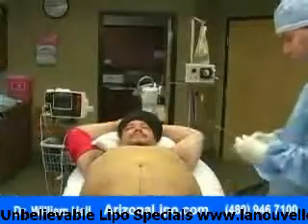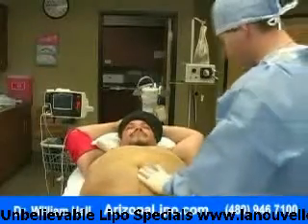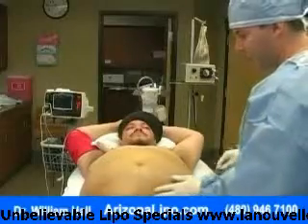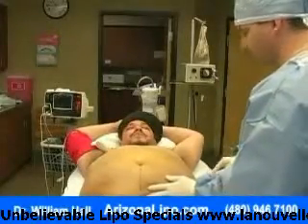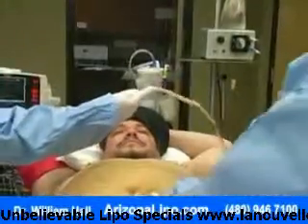Okay, so we're going to start the suctioning now, Alex. Okay. So mainly you're going to feel a little bit of pressure, okay? If you feel anything that is burning or pinching, you just tell me and I'll put a little bit more anesthesia. But mostly it's just going to be a little pressure. It's just kind of an odd sensation, huh?